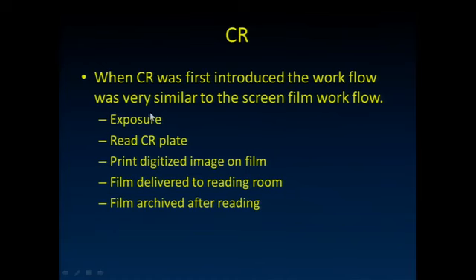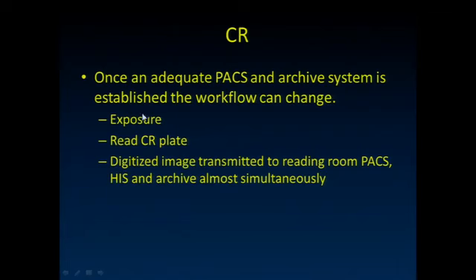You expose the CR plate, you pop the plate into the reader. Back then, they even digitized a film of it. Now that would just get sent to PACS after the plate was read. And that film was delivered to the reading room, and the film was archived after reading. So it was a nice natural replacement for film. It didn't require everything just be thrown out the door, if you will.